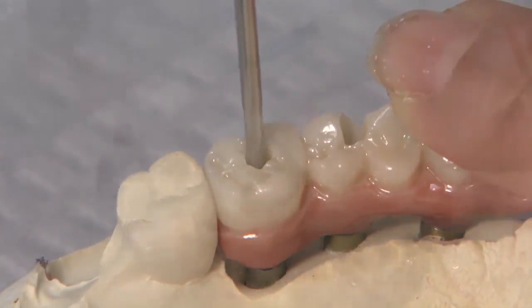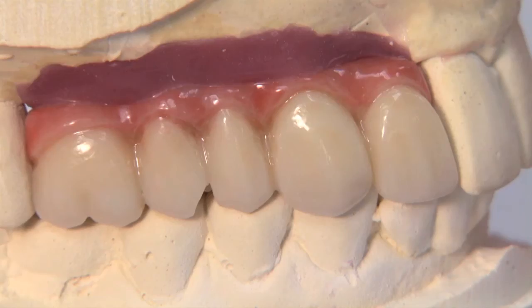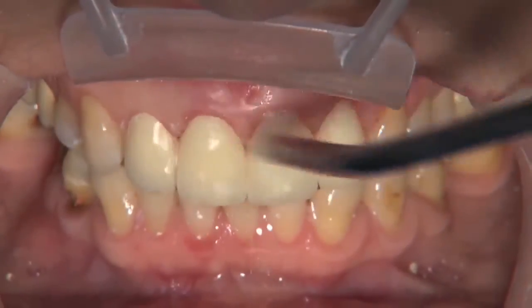After the curing is complete, the final Bruxer solid zirconia partial arched implant prosthesis is sent to the doctor and ready for delivery to the patient.